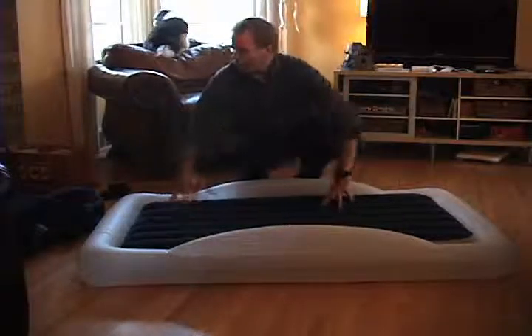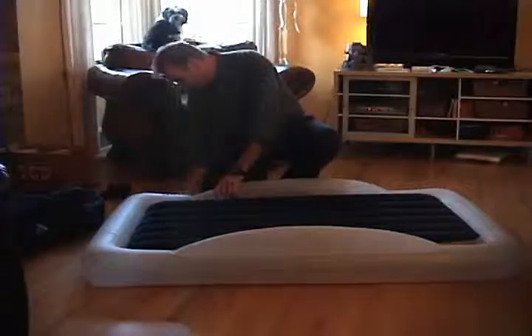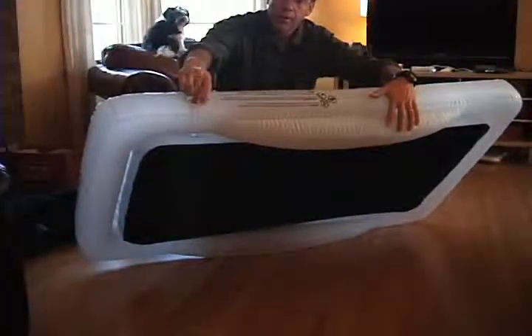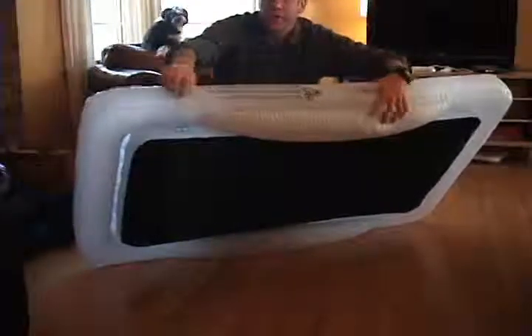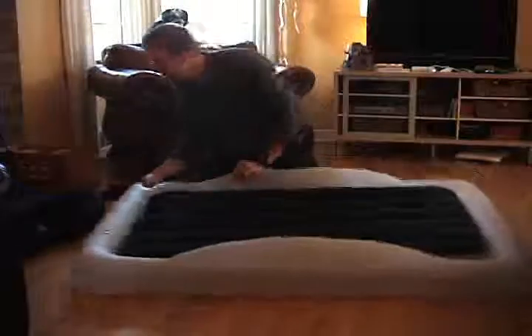After you've inflated your bed and you want to put on your protective cover, it's really simple. First, let some air out of your bed by just pushing in the valve — you'll feel the air flow. 10-20% of the total amount in there is all you need, just so you can bend it.